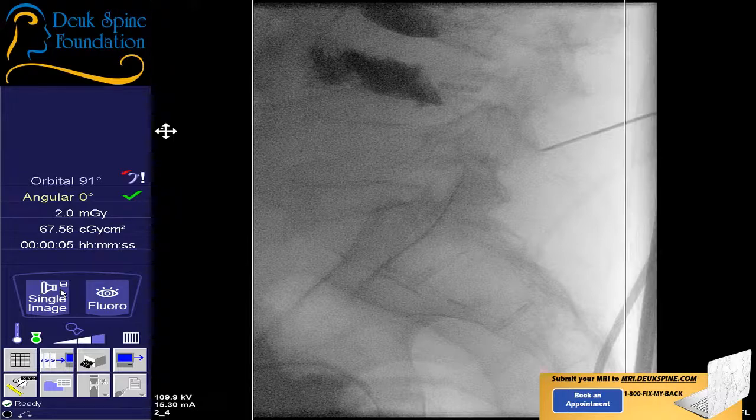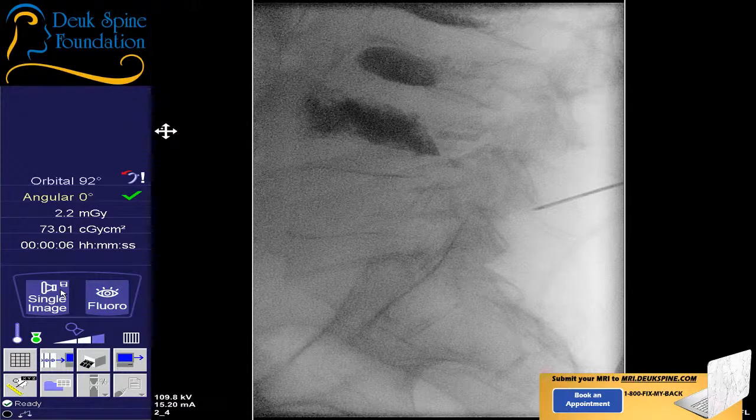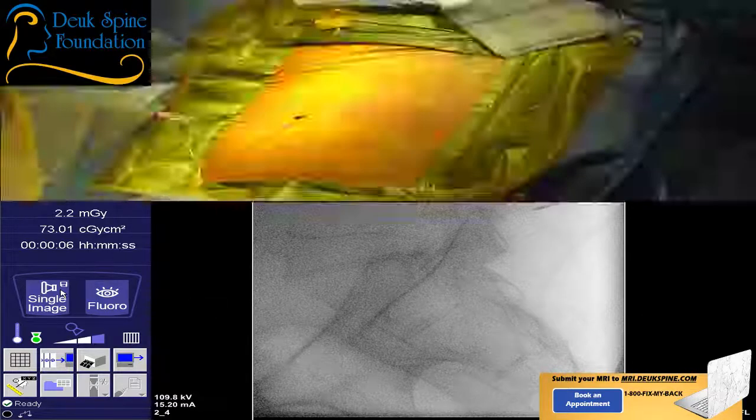What can you do there, Jordan? I don't think we're too far off. See if we can get those pedicles lined up just a little bit better. Shot. I think that went maybe the wrong way. Let's try the other way. It's not a wag, it's a rotation.